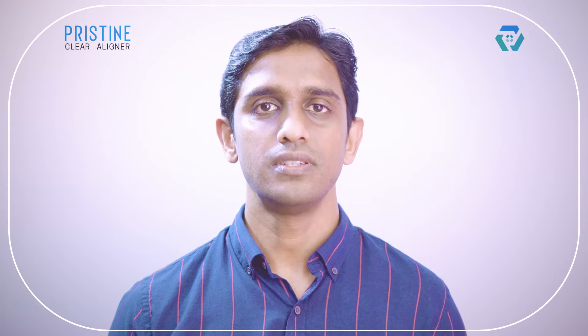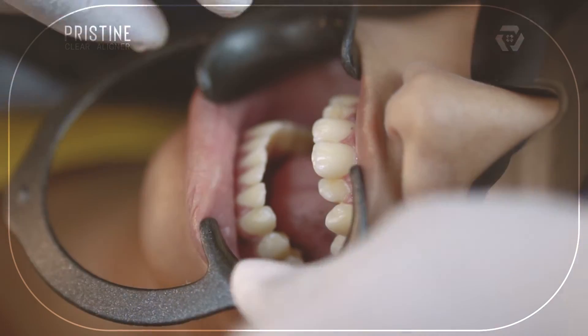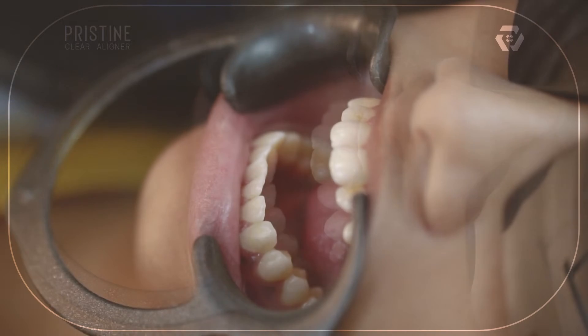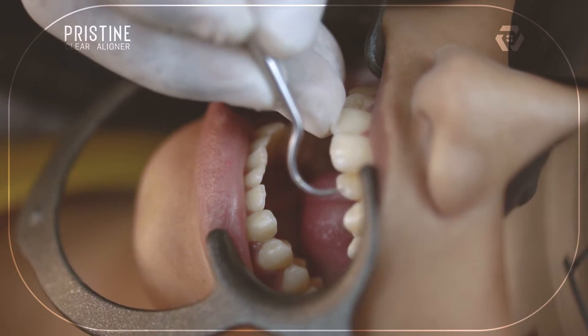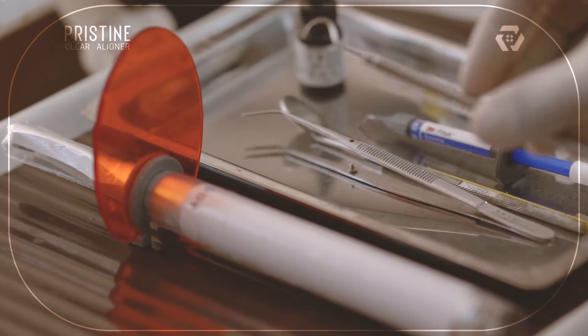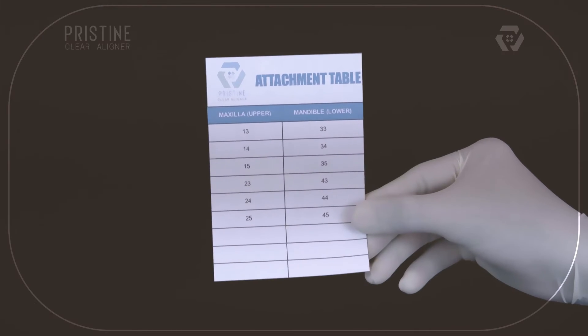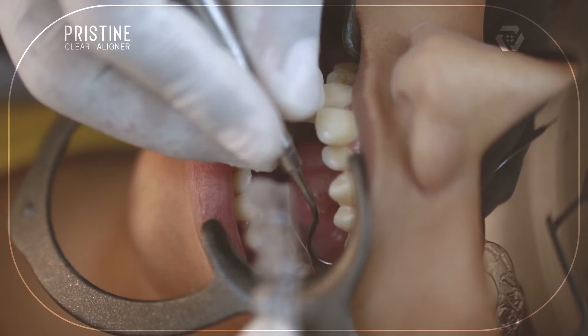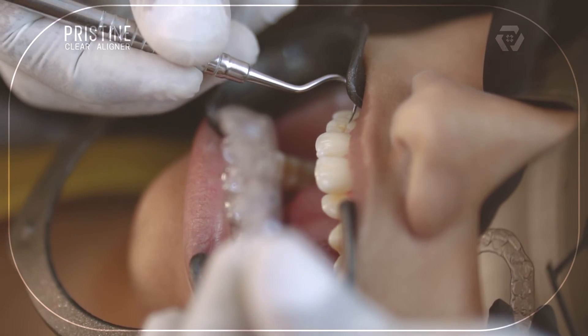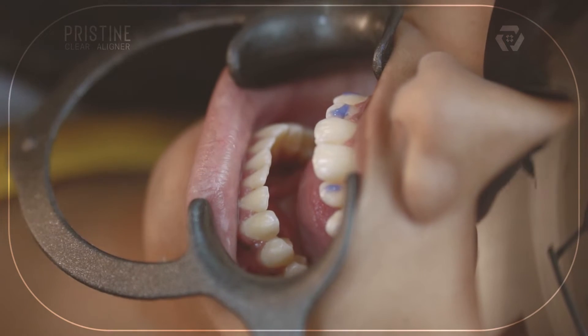If oral hygiene is proper, you can skip the scaling step. Now place the cheek retractor and locate where all the attachments are designed using the attachment guide and attachment template. The attachment guide tells you on which teeth attachments are designed, and the attachment template shows in which shape the attachment is designed. Etch the specific area of the teeth using 37% phosphoric acid.